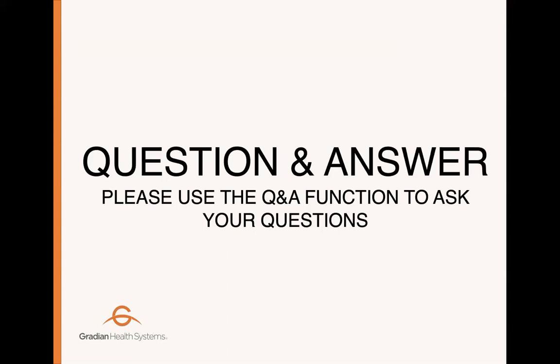If I take that question, I'm sure my colleagues are going to add on. From this webinar, we saw that oxygen is a drug. So if you're using a drug, you should monitor it, and you should have proper indication to administer oxygen. If you're giving oxygen, you should know how much you are giving. Dr. Koyamba has shown us how much FiO2 the nasal cannula can deliver, and how much the face mask can deliver. So how much is your patient requiring? Are you monitoring your patient?